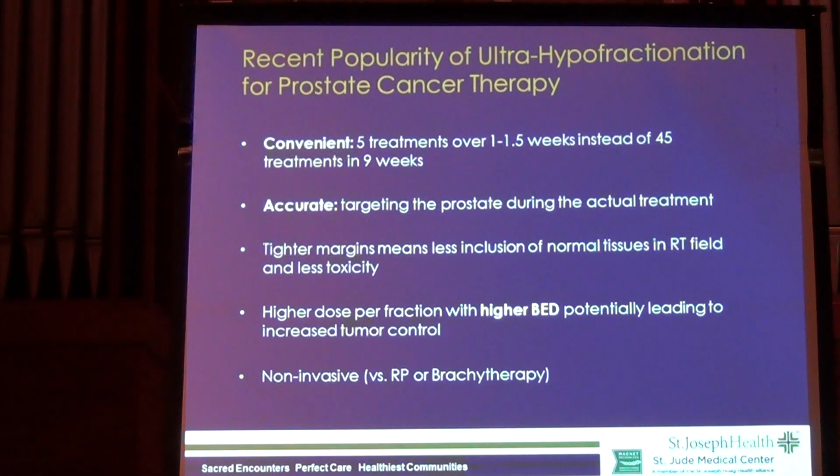And it's also non-invasive, so we're really using that as a differential from doing a prostatectomy or even the brachytherapy, the seed therapy. Those are invasive techniques. This is all external. There is nothing internal in terms of radiation being given off.